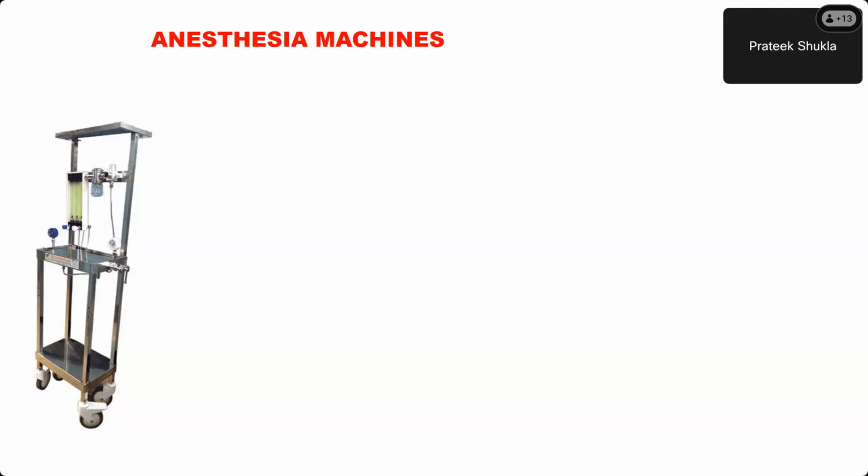Do you have 2 oxygen yokes here? Look at the picture and tell me. No, sir. You can see only 1 yoke. Okay, this is called the yoke assembly where you mount the cylinders. I purposely wanted to put this picture because the current day students are not aware how to fix a cylinder in a machine. In the workstation, where do you find the spare cylinder?